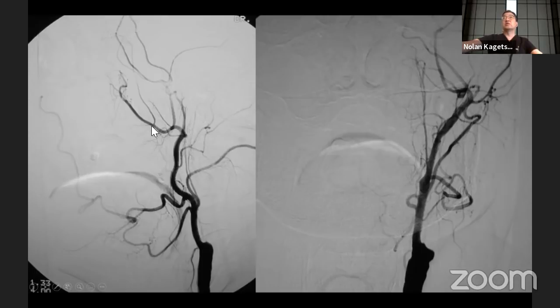This is the internal maxillary artery, and you can see that would be this one here. The internal maxillary artery is probably the main culprit for epistaxis. So I used to treat people with epistaxis. You'd guide the catheter all the way up here. You make a few turns, avoid a few wrong turns, and you put the catheter tip about there, and then you inject particles and treat epistaxis.